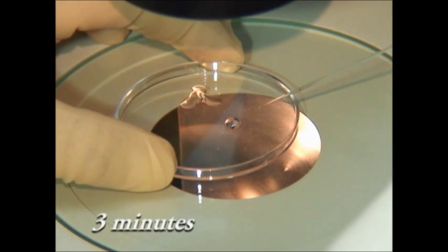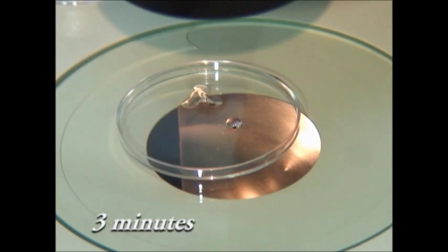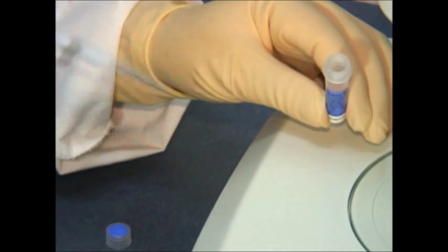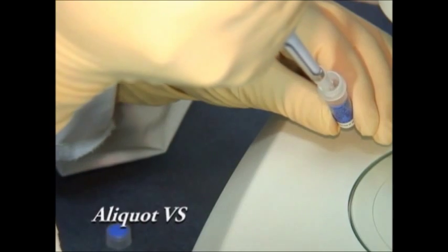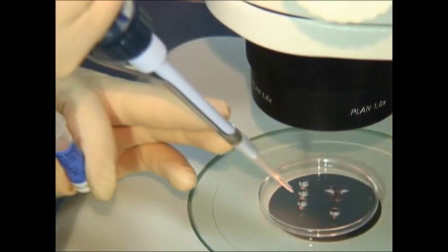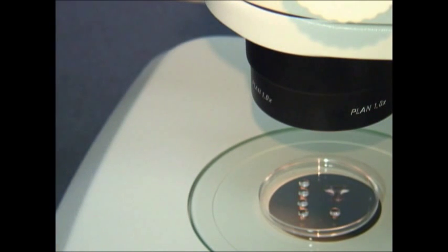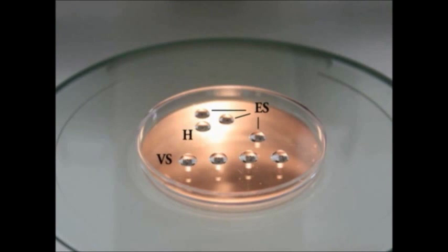After three minutes, the drop is merged with the second drop of equilibration solution and kept for further two minutes. After two minutes, the eggs are picked up using the pipette and transferred to the third drop of the equilibration solution and kept in that drop for three minutes.